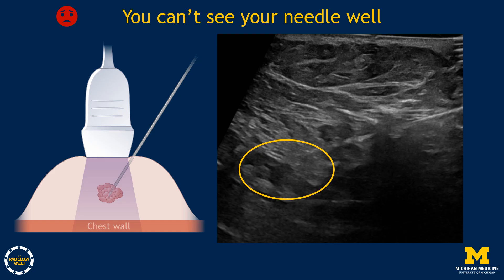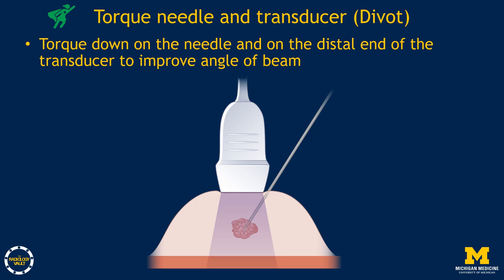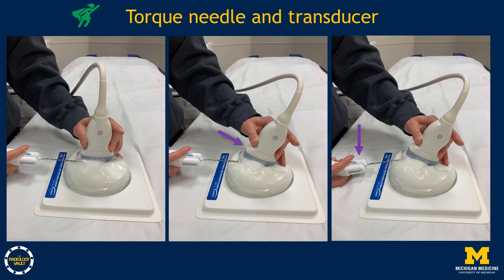The next problem is poor needle visibility, which most often occurs when the angle between needle and transducer is acute with a deep mass. You want the needle as parallel to the transducer as possible. When planning, make the incision as far from the transducer as possible. If that's not feasible, torque the transducer away from you to increase the angle, then torque the needle down to increase it further — this should bring the needle and transducer closer to parallel. These torques create visible divots in the skin, which can also be seen on ultrasound images. These motions are not exaggerated.